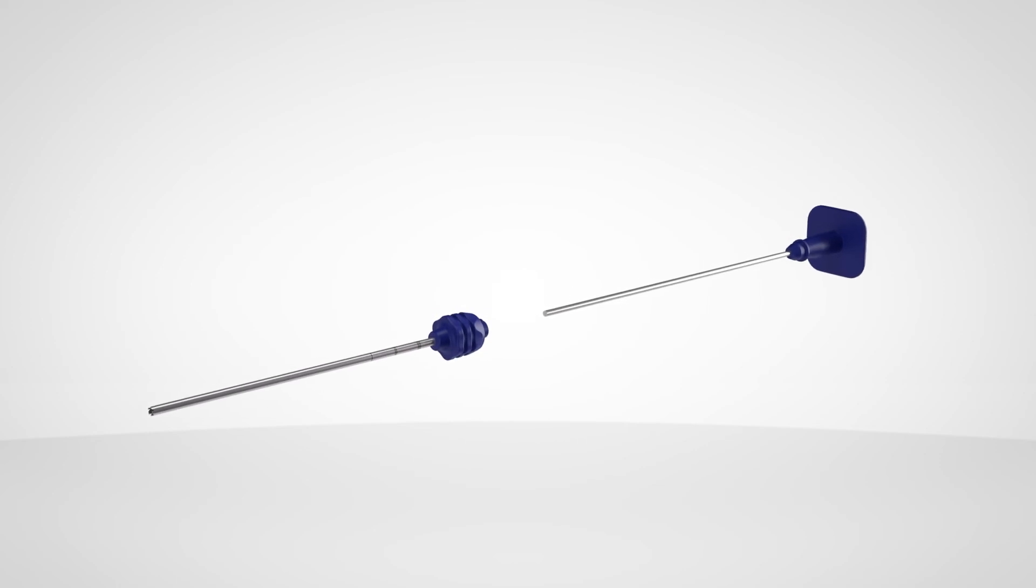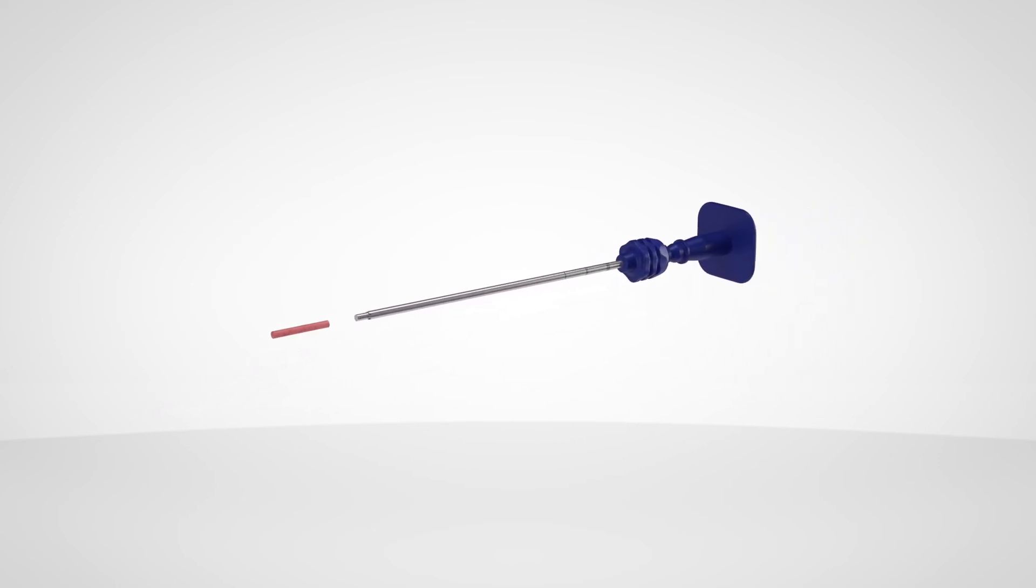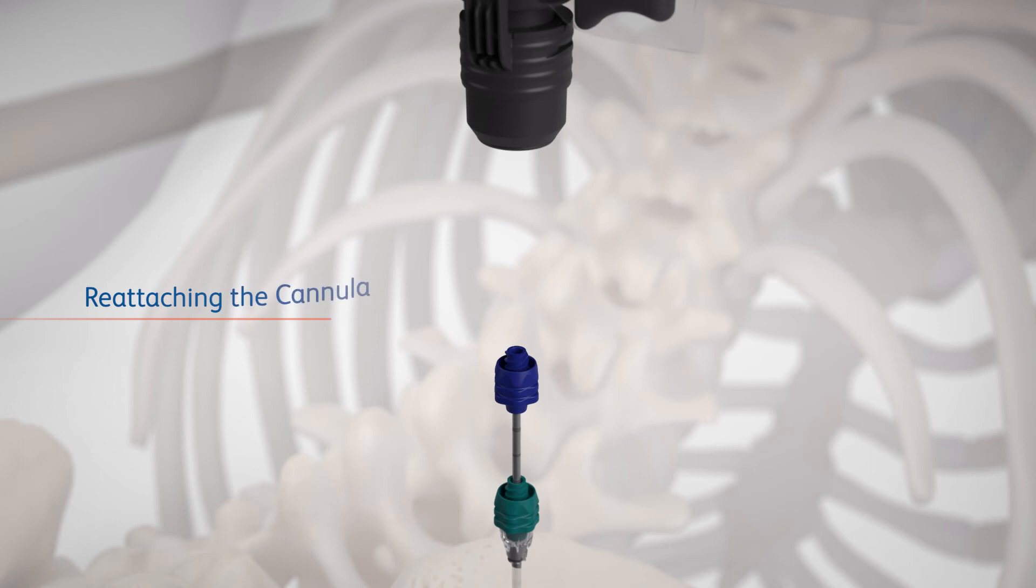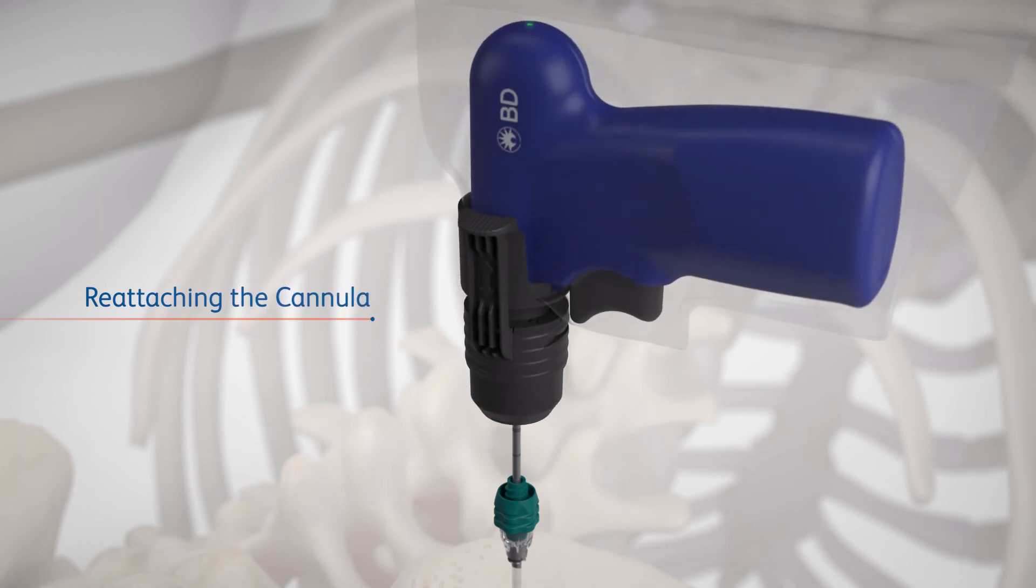To eject the biopsy sample, insert the ejector rod through the biopsy cannula hub. That will allow the sample to be ejected from the biopsy cannula tip. If desired, the biopsy cannula can be reattached and used to take additional samples.